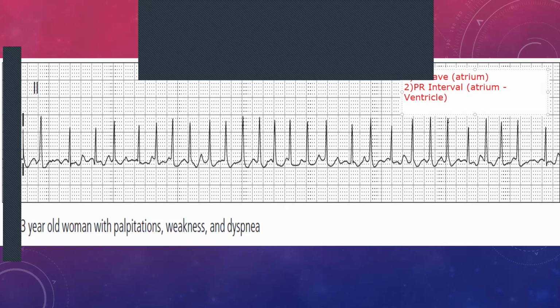Number 3, what we're looking at is the QRS complexes themselves. If any of this seems odd or you're lost in the terminology, and not necessarily the doctors who are on now, but anybody later on, you can always go back and have a look at the very basics of the ECG that I cover in another section, and that should help as well.